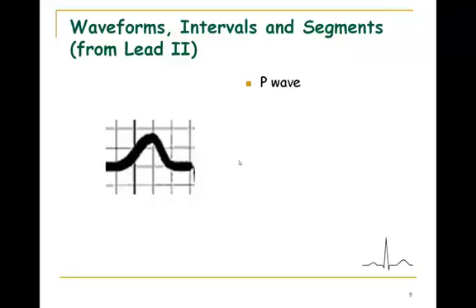If the P wave is a little higher than normal, not symmetrical, or maybe a little bit more prolonged, that can indicate problems with depolarization of the atria. We may see things with some abnormal generation of the impulse, such as the example of an inverted P wave in lead 2, if we had an impulse being generated from near the AV node. You can get changes in the P waves with atrial hypertrophy. But we're not going to really concentrate on atrial hypertrophy this trimester. It's more ventricular.